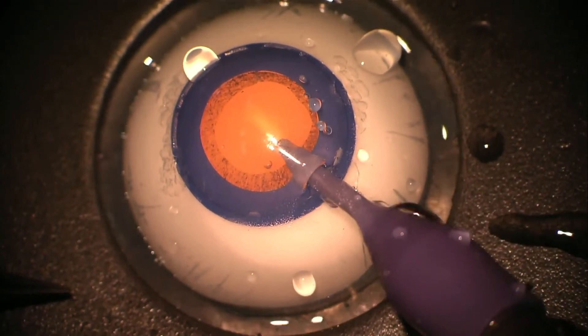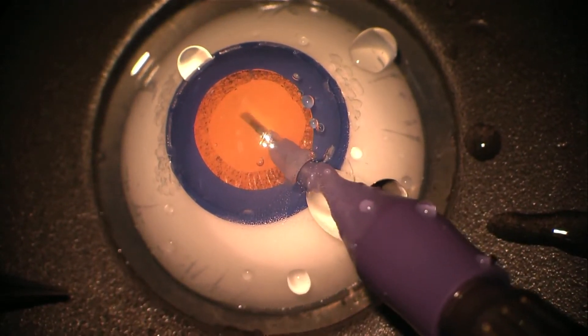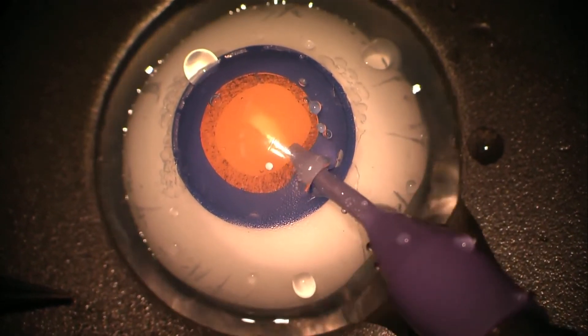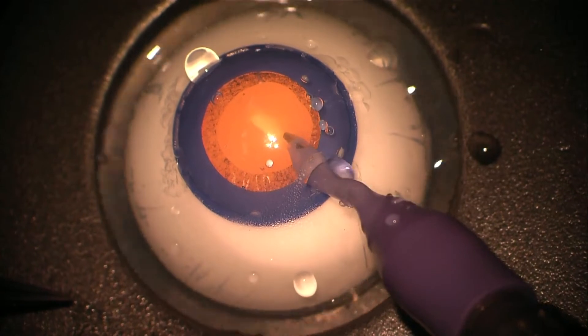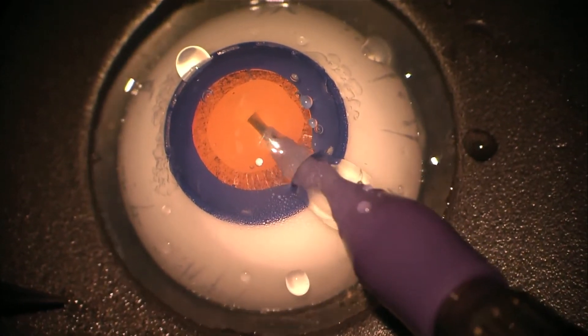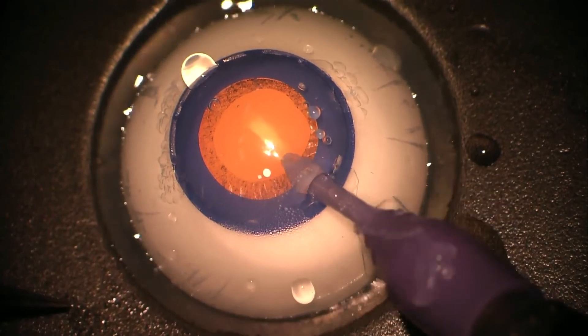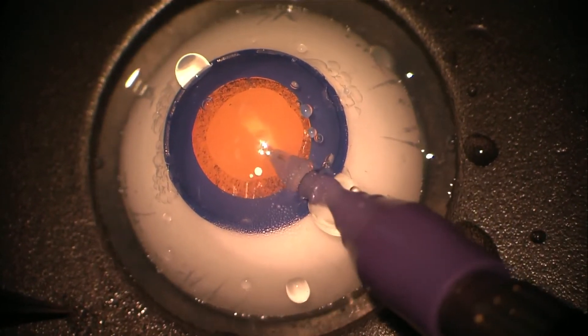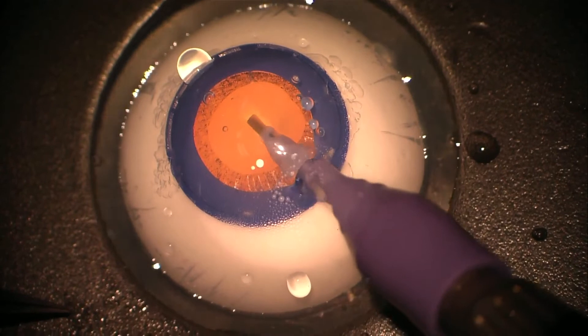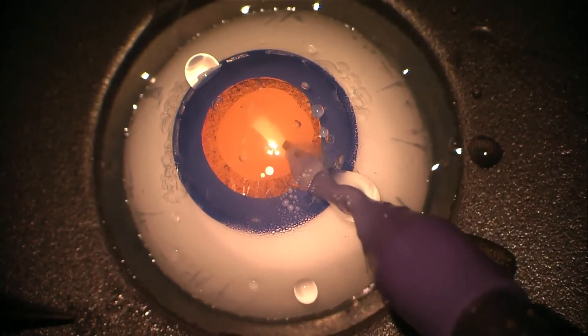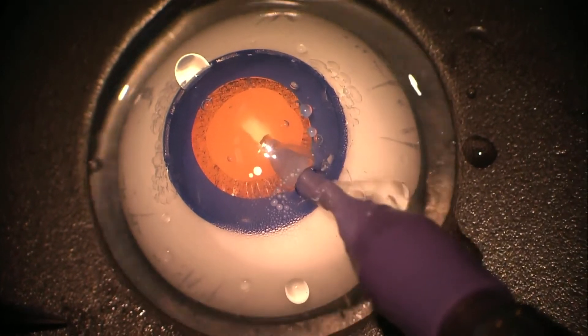to remove the nuclear material. As you get deeper, although there's no posterior capsule, you can see that light reflex which lets the trainee know when they've got to the correct depth. Just going down the back slope to create a nice uniform rectangular profile of the initial groove.